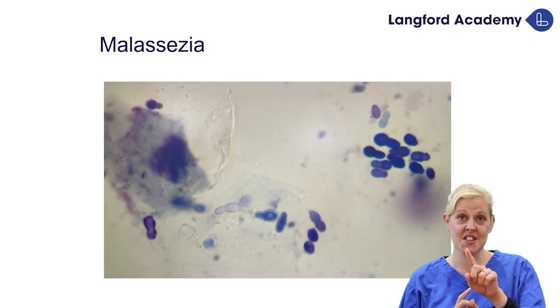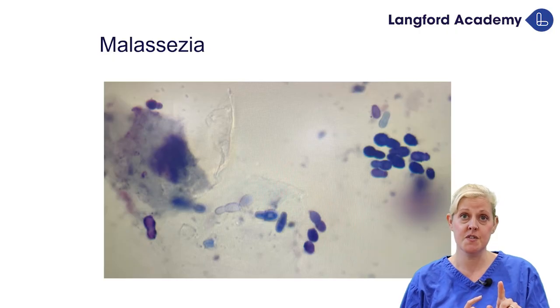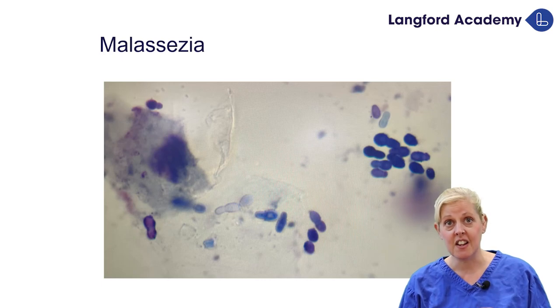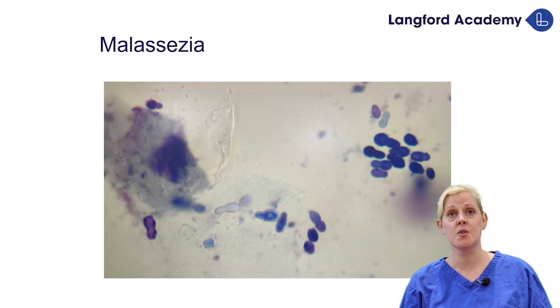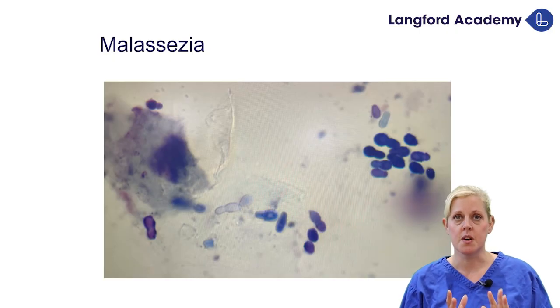And you can actually see here, there's some that have taken up a ginormous amount of the stain, but if we look over to sort of in the middle, around about the 9 o'clock mark, there's a fairly see-through one. So this really highlights, as I was saying to you earlier, really extend the amount of time that your sample has with these stains. Otherwise, this is what you're going to see. You're going to see always these outlines, these ghost cells. And you need to, particularly with like really gross ears, you're going to need to get through a lot of layers of crud. So really think about how much time your stain has in contact with your sample.